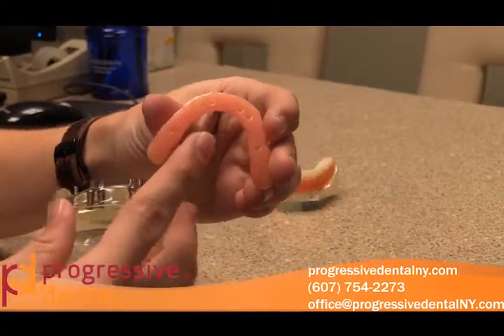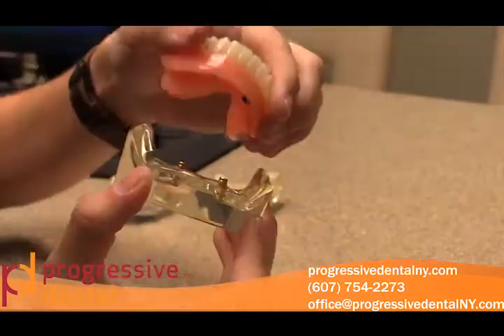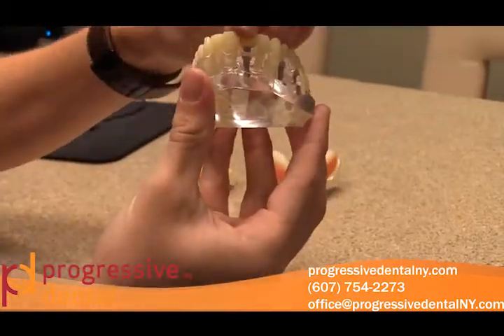The reason most people get implants is to replace a single tooth, multiple teeth, or an entire dentition. Say you have a full denture and no teeth, and the dentures move or are sloppy and you want them more secure or more anchored. That's one place where a denture can be stabilized, by having something to fix it to, be it screwed in place or snapped into place. The other way is if you have a single missing tooth and you want to replace it, and the teeth around it are good and you don't want to touch them. An implant can be placed, and then a restoration, typically a crown with its necessary abutment underneath it, is done on that implant to replace that tooth.